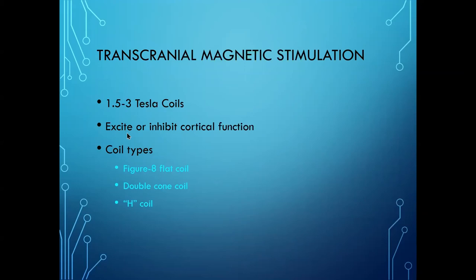If you don't look at the brain activity, and classically they do not, you don't know that. And you won't know if there's a beta spindle on the right that you should inhibit, or if this is just that left frontal classic target for depression. Now, in TMS, there's different kinds of coils that they use. A figure eight flat coil, which is just for surface cortex. It doesn't shoot a deep pulse.